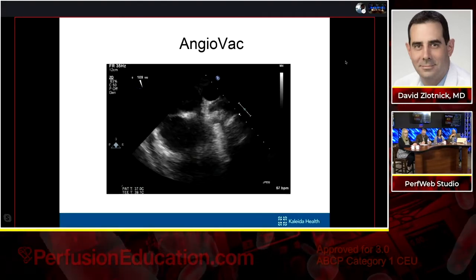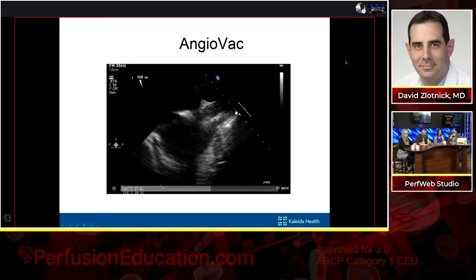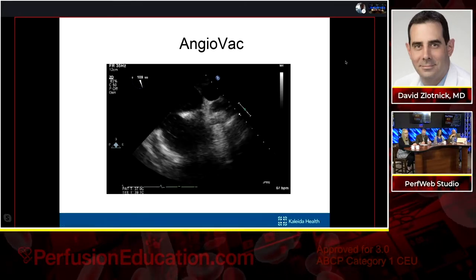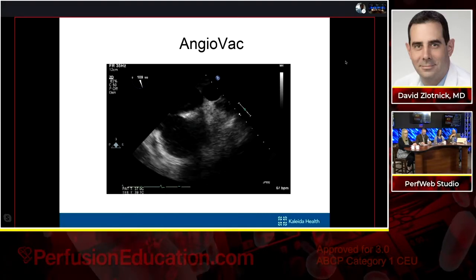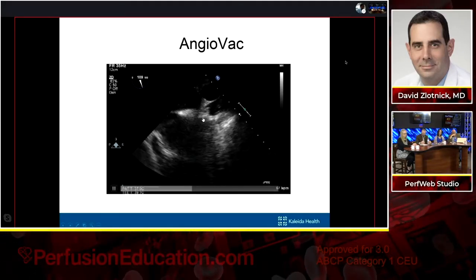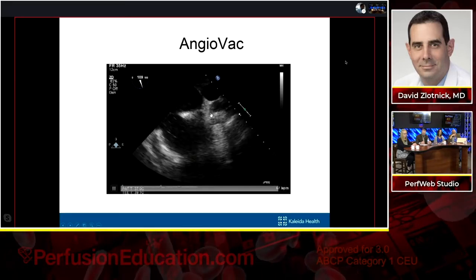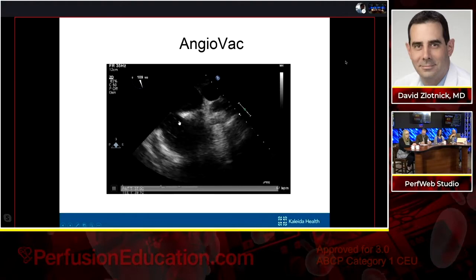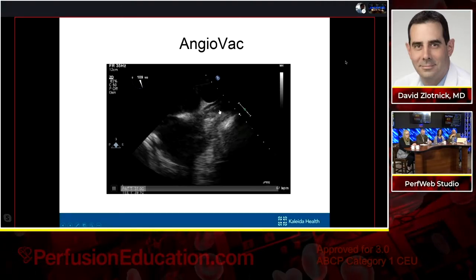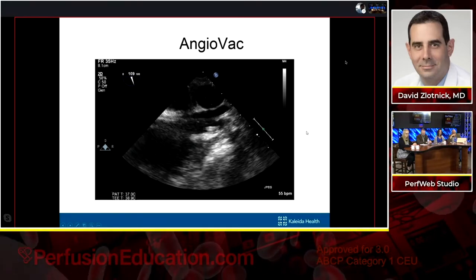So in this instance, we ended up bringing her for an AngioVac, and because we were AngioVacing the SVC, we decided to come from below. Coming up through the IVC, it's a straight shot through the right atrium up to the SVC. This is what we're seeing here. Here's the AngioVac cannula. This is the second generation, so we have the balloon tip, and we're working our way through the right atrium up into the SVC, debulking the clot a little bit at a time. And here's another transesophageal image.